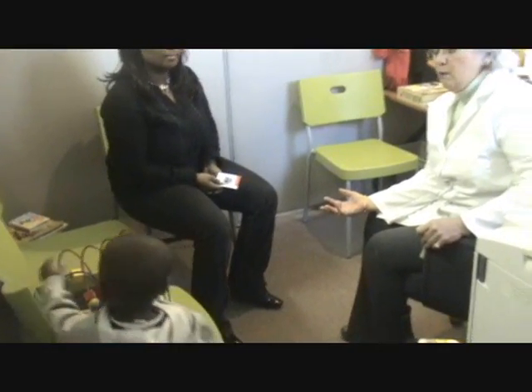Welcome to DNA Connect. My name is Roberta Ginsburg, I'm the director, and I'm going to demonstrate to you today how to do a sample collection — a mouth swab, buccal swab sample collection. This is Monica and this is her son Trey, and we're going to collect samples from both of them.